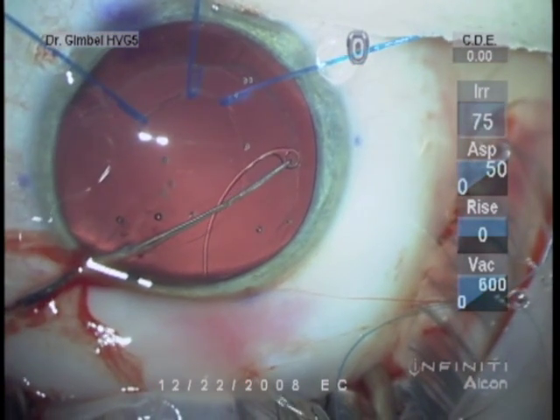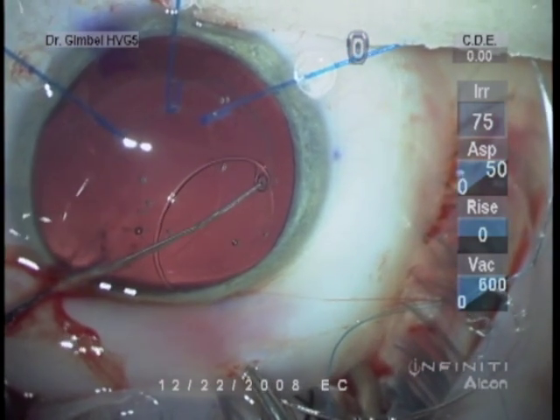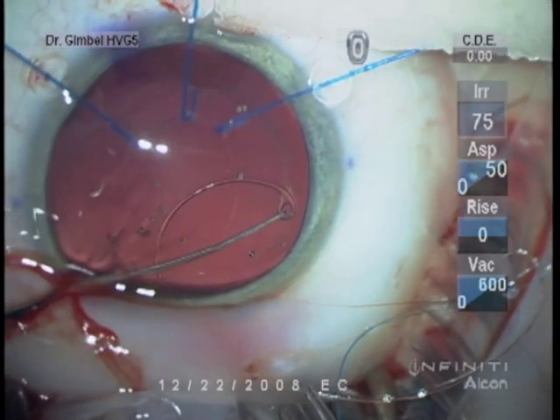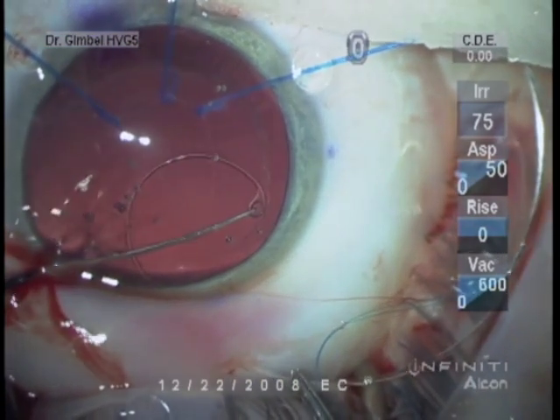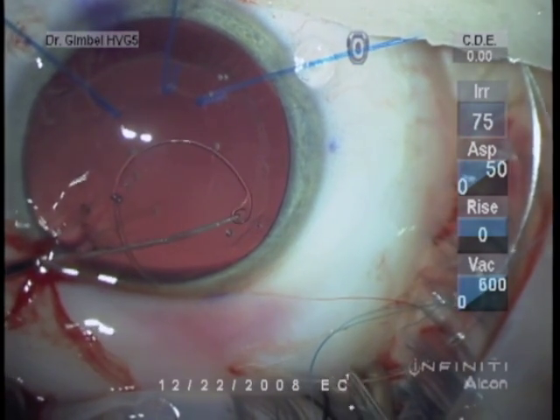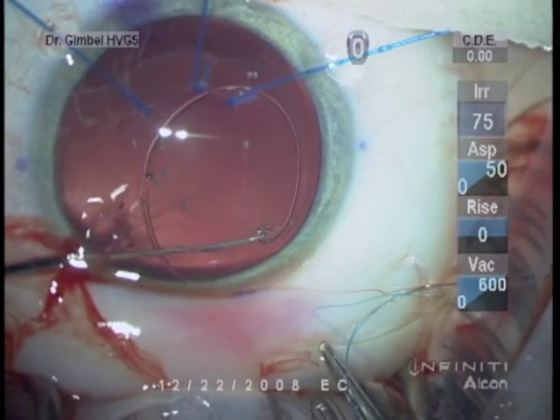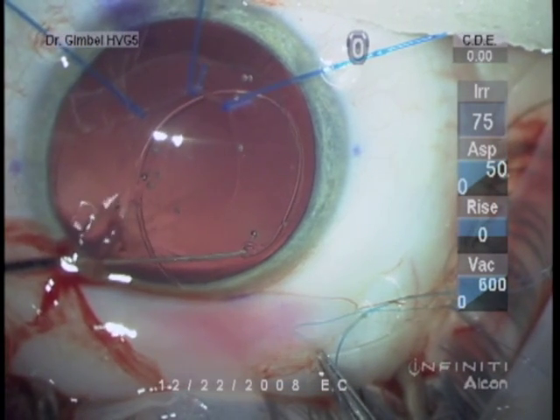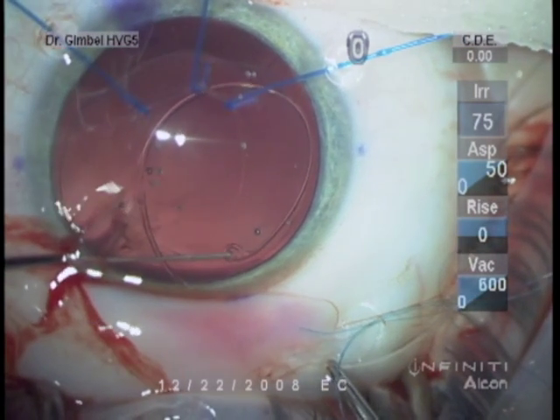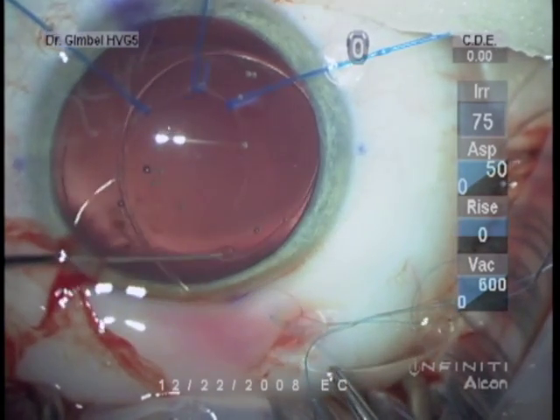So I hold it with a Sinski hook to create a nice arc of the ring, so that its initial contact with the capsular equator is very blunt. Make sure the Sinski hook has an almost more-than-right-angle tip, and you can take a needle driver and bend it more if need be, to make sure it doesn't slip off the end of your Sinski hook if it's a straight right angle.